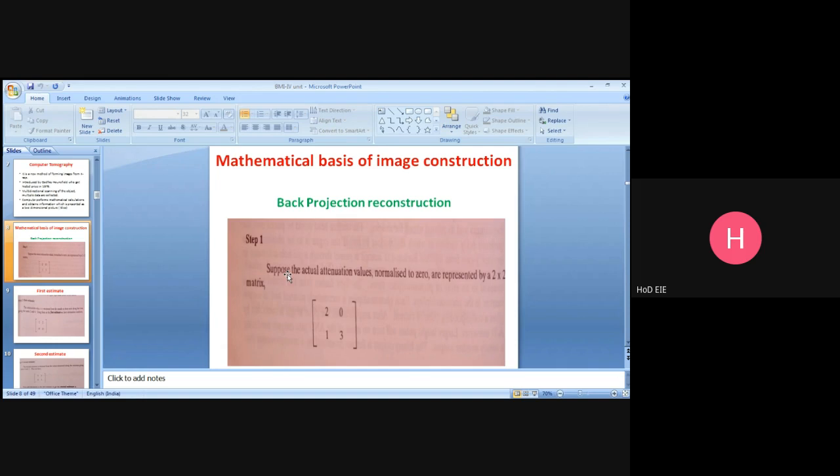As I told you earlier, the attenuation values which you are taking across the surface of your slice can be computed from the externally measured attenuation factors. The computer which you are using creates different angles, other than 90 degrees to the body axis.